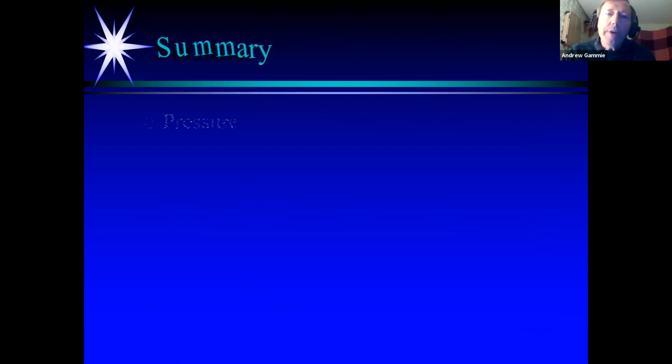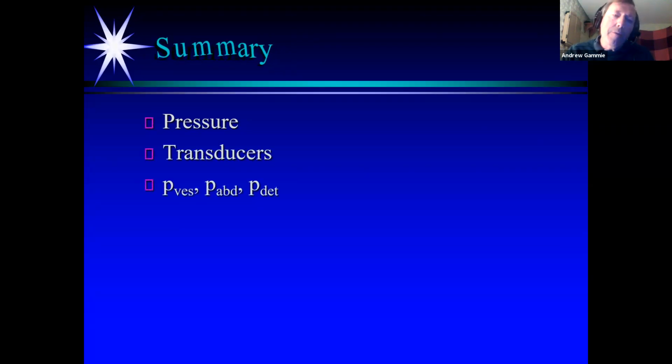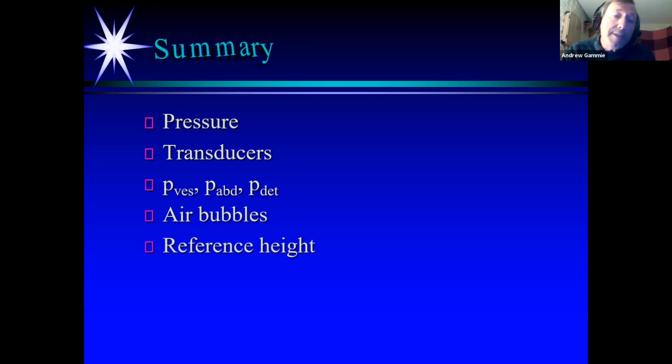So in summary, this very brief tour through physics has given you an idea, I hope, of pressures and transducers and what we're measuring. You've got the idea that air bubbles are wrong and that reference height is right, and that 0 is a necessity.